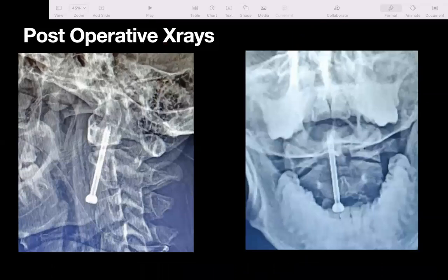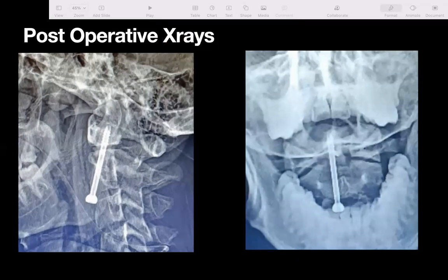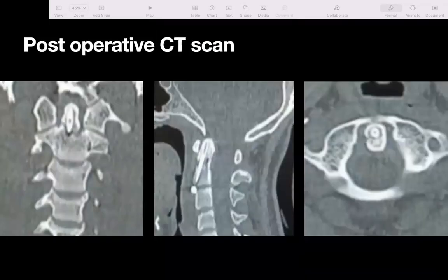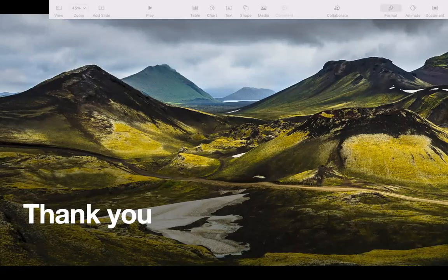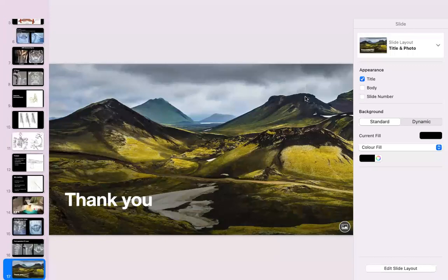On post-op X-rays, the odontoid looks anatomically reduced and the screw position looks quite acceptable. Thank you very much.